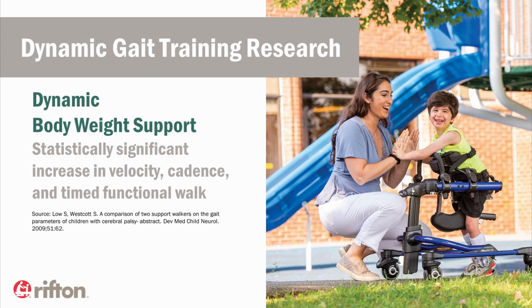And for the subgroup of children with no previous gait trainer experience, there was a statistically significant increase in velocity, which is the distance covered in one direction per the amount of time. Also an improvement in cadence, the quality of rhythm and regularity of their stepping movement, and an improvement in their timed functional walk. So the child's self-paced walking function was faster with the dynamic gait trainer.